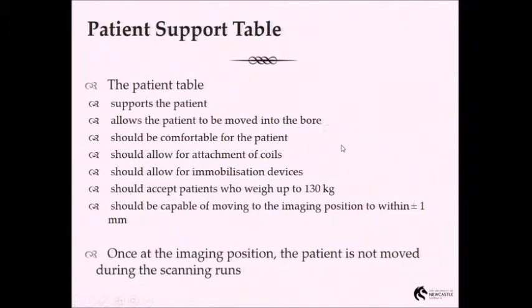A couple of very simple things: it needs to be comfortable, so scans can take a considerable amount of time in some cases. For my concussion studies, I normally put patients inside the bore for about an hour and 10 minutes because I run a lot of different things on them. It has to have attachment for coils. So when we look at particular body parts, we tend to use coils to target one particular body part.